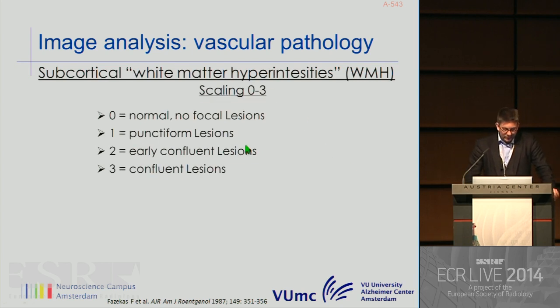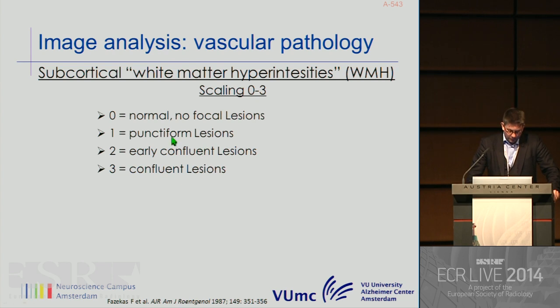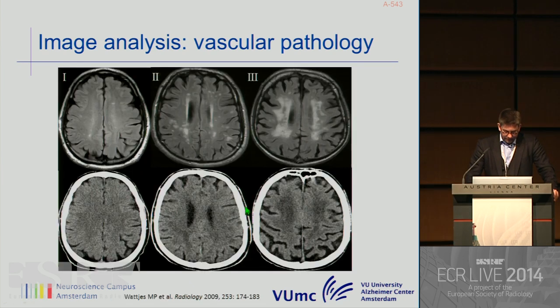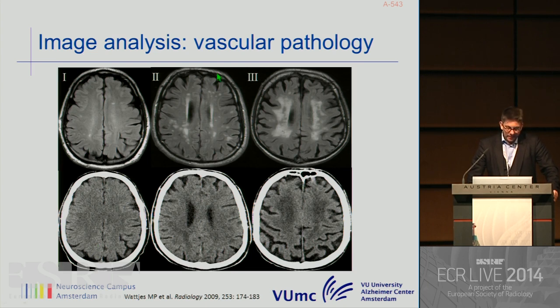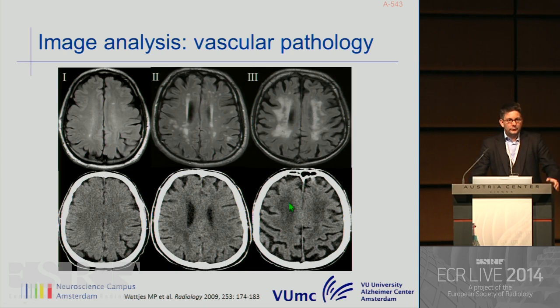Moving to vascular pathology: subcortical white matter hyperintensities can be easily rated according to the Fazekas score, a four-point scale from 0 to 3. Grade 0, no lesions; grade 1, punctiform lesions; grade 2, early confluent lesions; grade 3, confluent lesions. You can also apply this to periventricular caps and bands. The punctiform lesions on FLAIR can be difficult to find on CT, but the more clinically relevant confluent lesions on MR can be easily appreciated also on CT. In other words, the clinically relevant pathology on MR can also be easily assessed on CT.